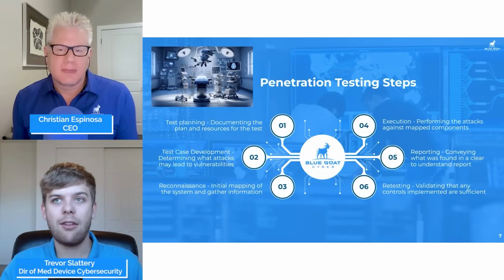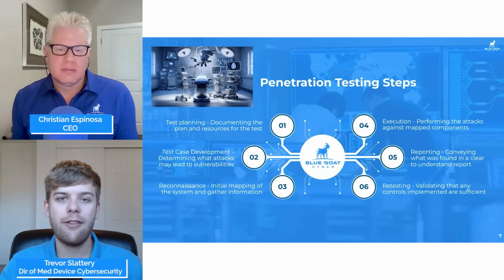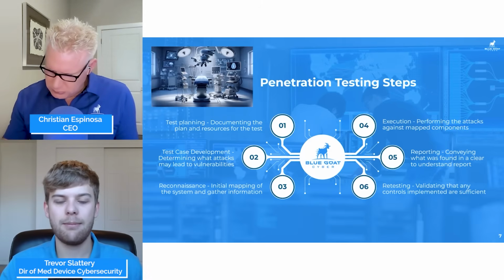If we are not given that level of access, we're going to have to get this information ourselves. So there are a lot of tools out there, depending on the device, depending on the interface, that are going to bring in a lot of information about what security controls may be present, what different components are in use, things like that, that can give us a better idea of what we can do to compromise the system.